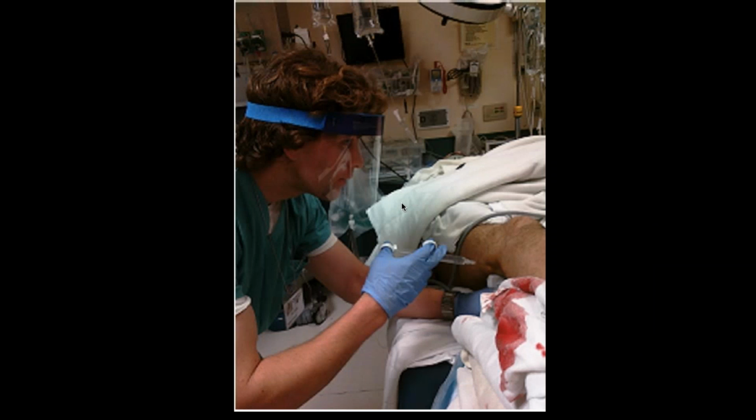So here's what that looks like from a surface anatomy perspective. This was a friend and colleague of mine named Dr. Chris Childs performing a block in a multiply injured patient for ankle fracture dislocation. You can get a hint there in the back that the patient's in a C-collar, which was the reason he had to be supine. So he's propped up distally, and then Chris is holding the probe underneath his thigh and entering nearly horizontally and in plane to target the sciatic nerve.